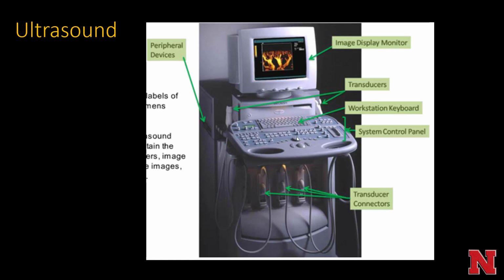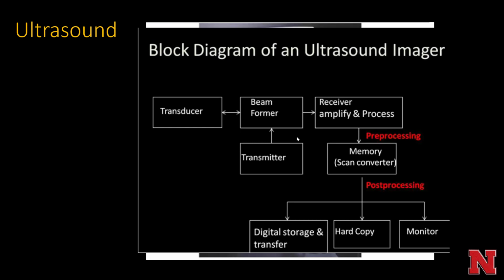For intraoperative ultrasound, oftentimes there'll be a setup which you can use for putting a sterile probe cover on, as well as some other niche products for specific or more targeted ultrasound transducer setups.